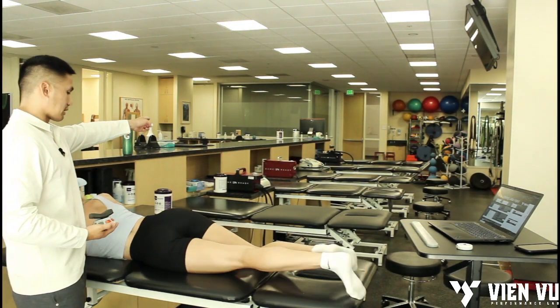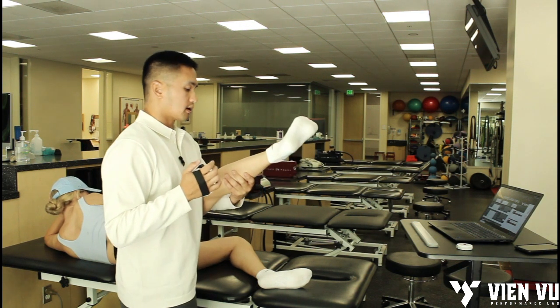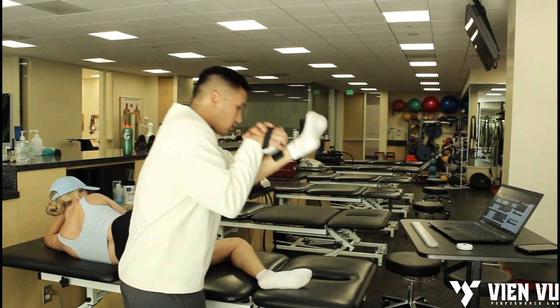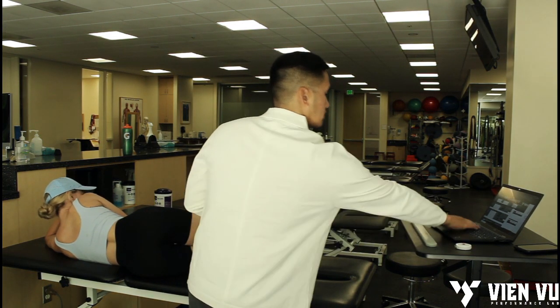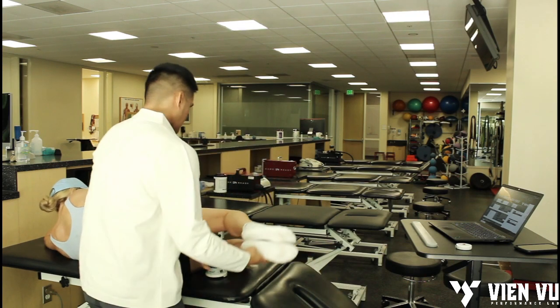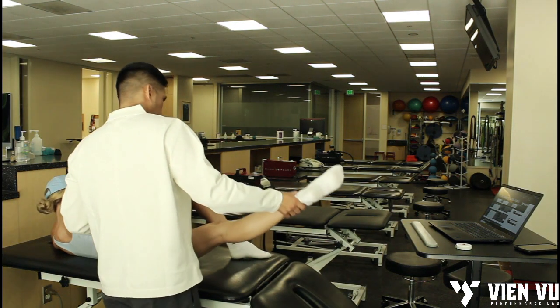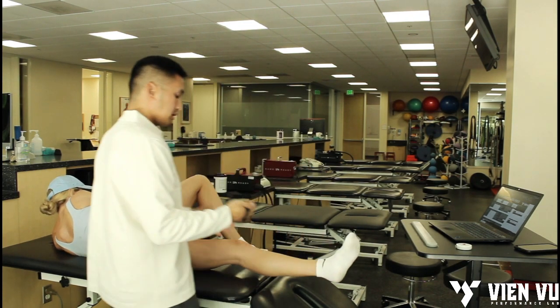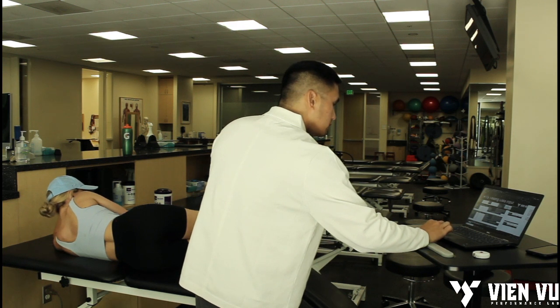Now I'm going to have you lay on your left side facing that way, and we're going to test your involved abduction. When I say go, you're going to hold and don't let me beat you — ready and go, hold it, hold it, and rest. That's involved abduction. Then we're going to do adduction — move this down, get this leg straight, scoot more on the table, and hold. Ready and go — push, push, push, and good.